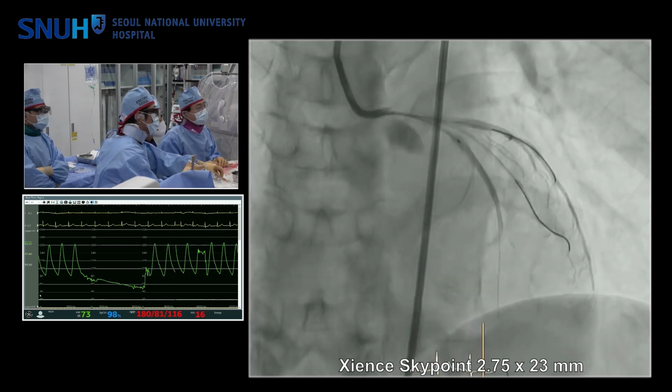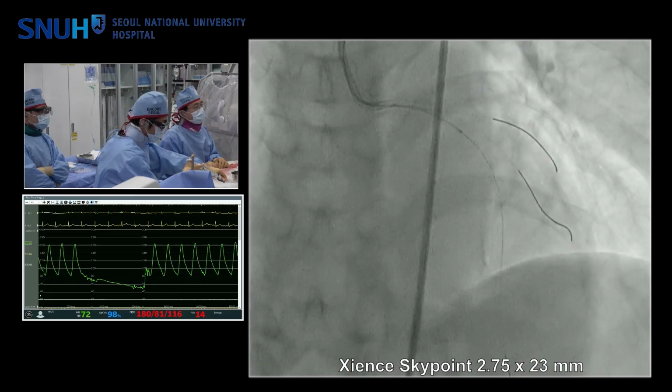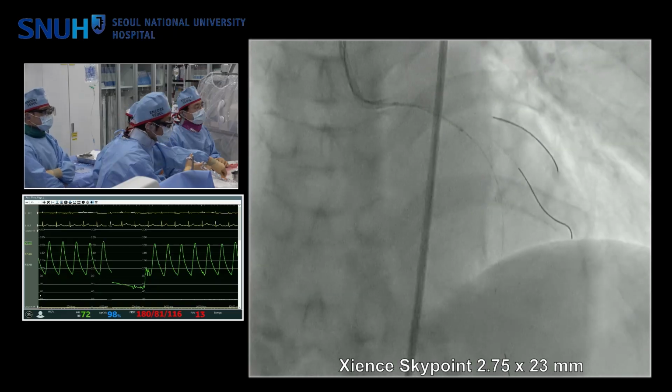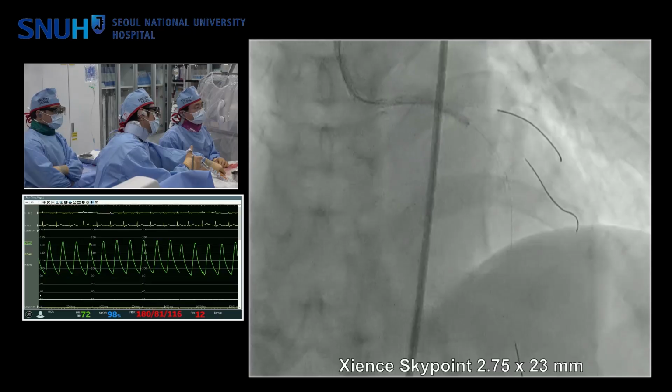What about the Japanese experience of DCA plus DCB? Yes, especially ostium. That is my field, and so optimal DCA is possible. Long-term data is very, very excellent.